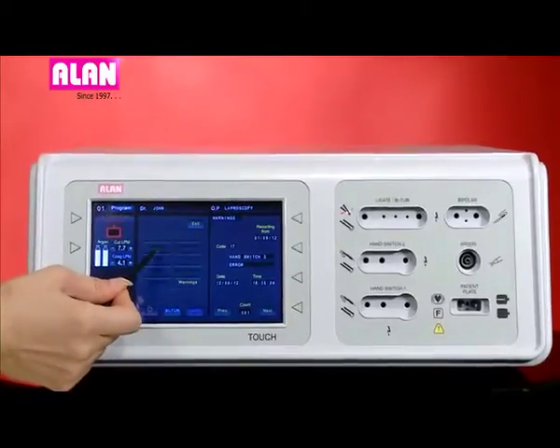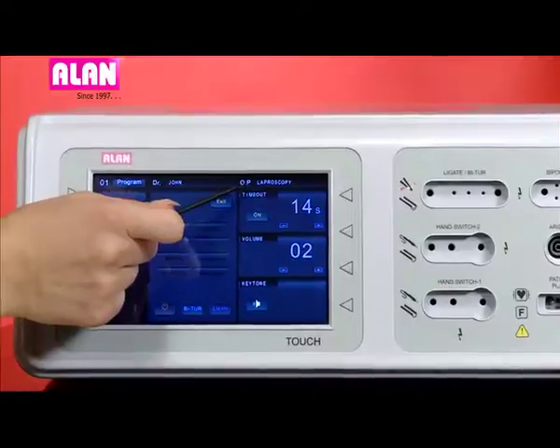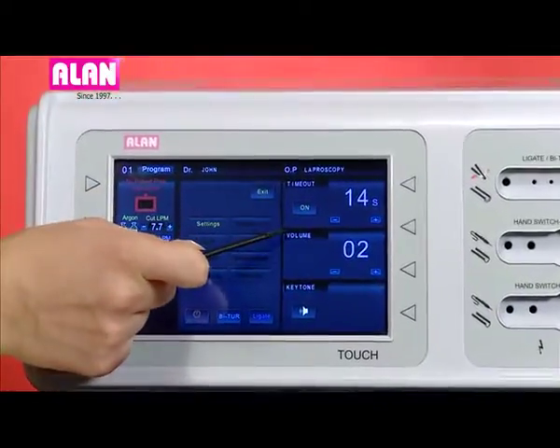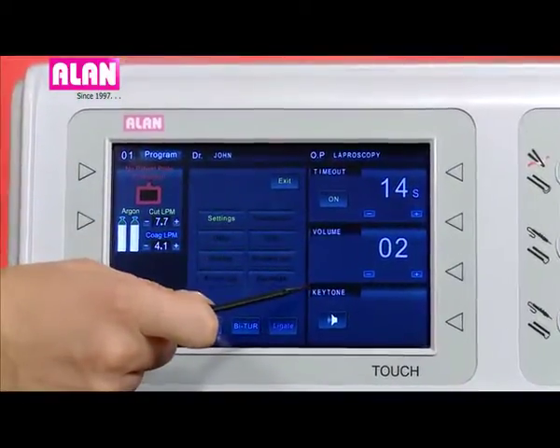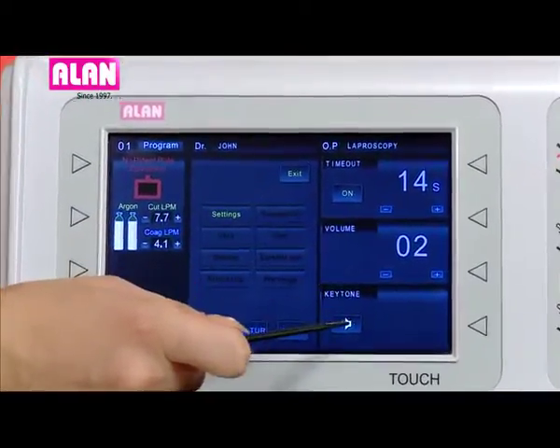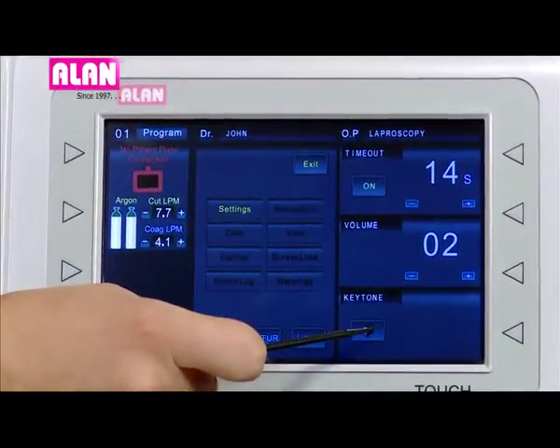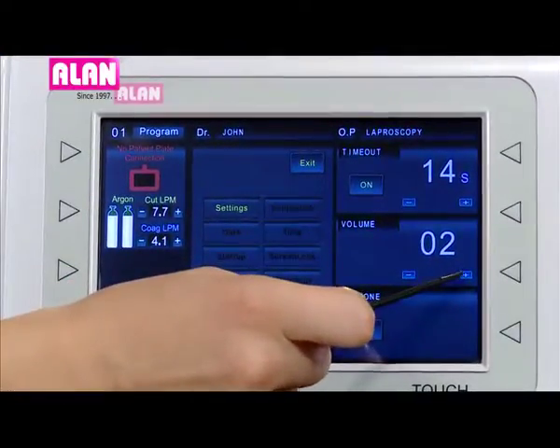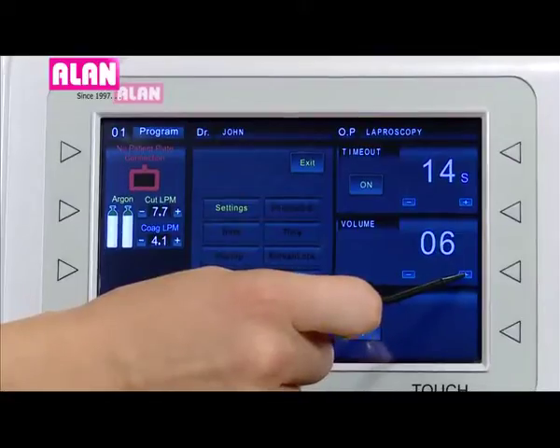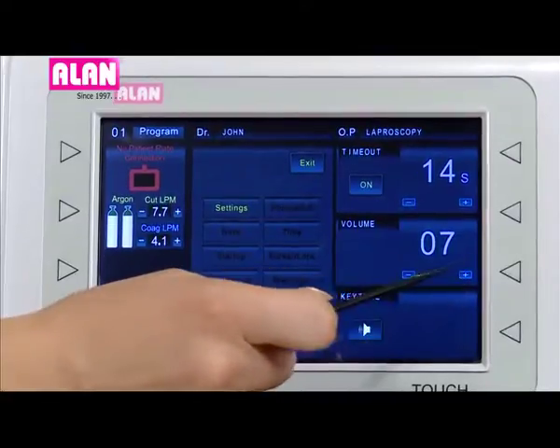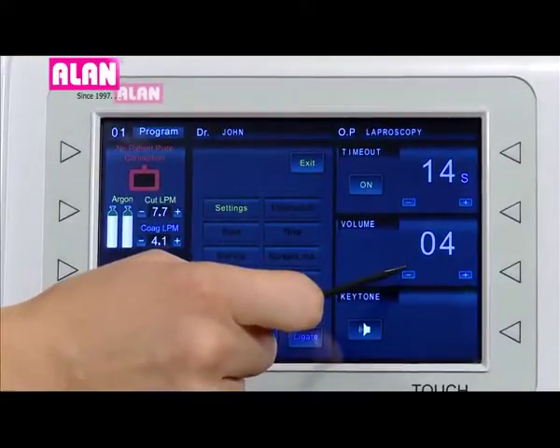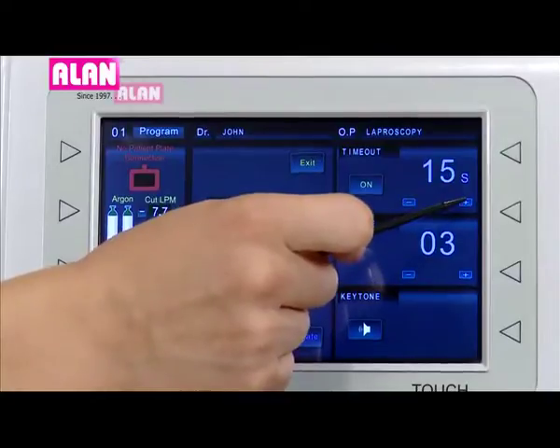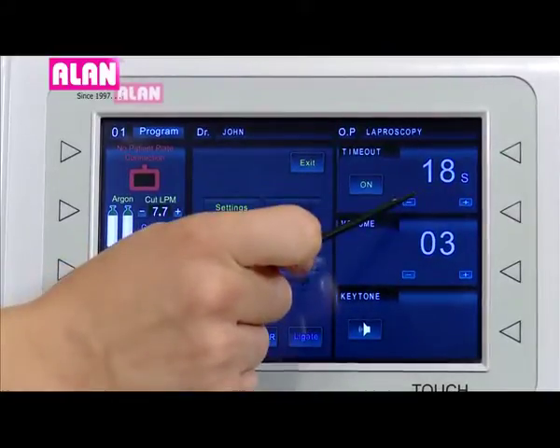In settings we have timeout, volume level selection, and key tone on and off icon. Volume level can be selected from 1 to 9. Timeout can be selected from 10 seconds to a maximum of 30 seconds.